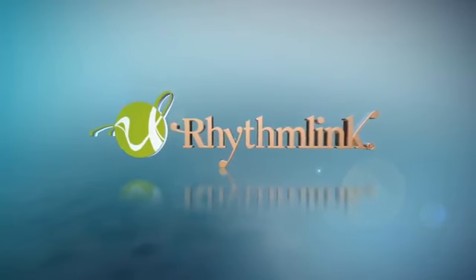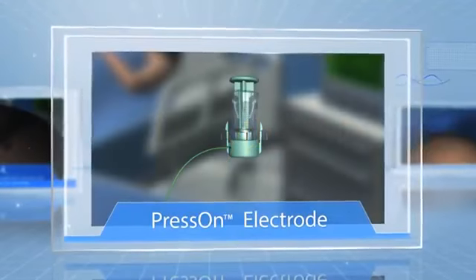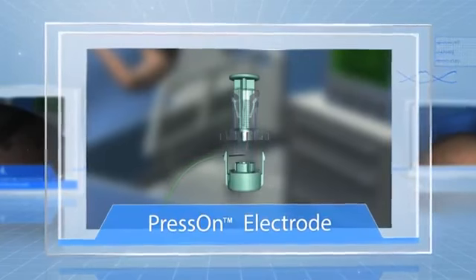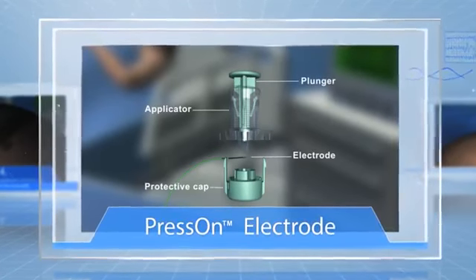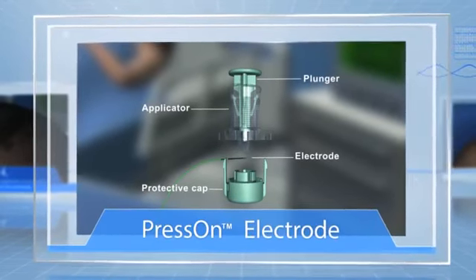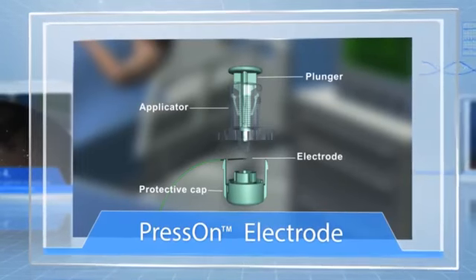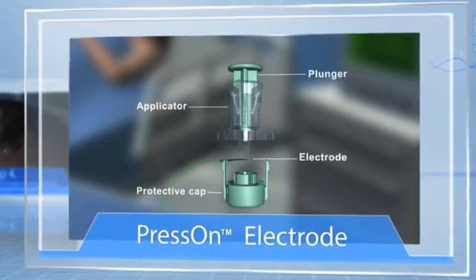RhythmLink introduces the disposable press-on electrode. This innovative electrode is housed in its own individual dispenser. The dispenser consists of the plunger, applicator, protective cap, and electrode with lead wire.